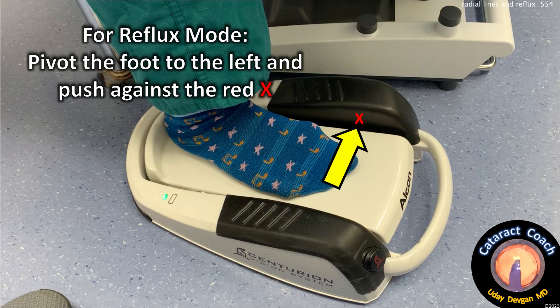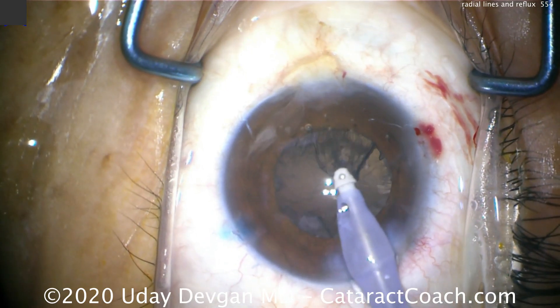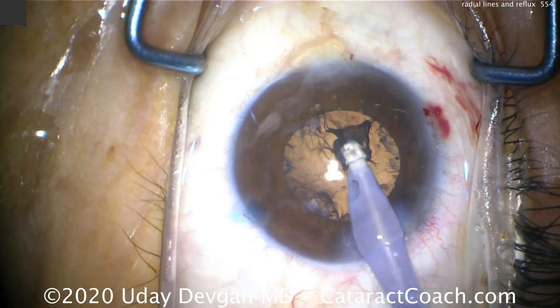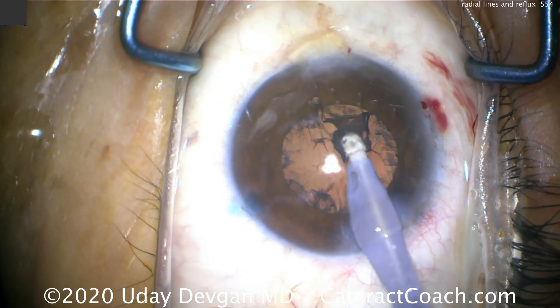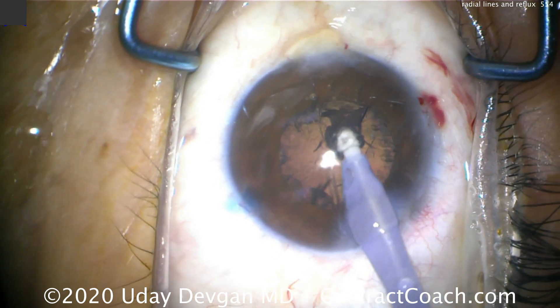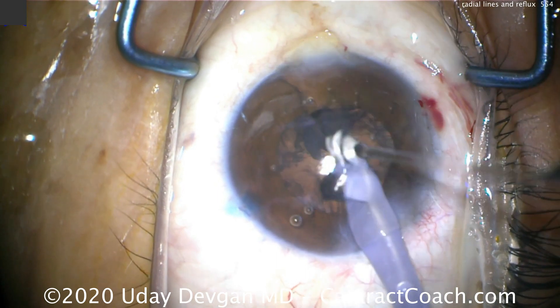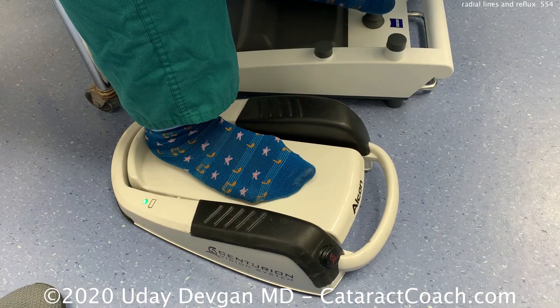Reflux mode: you're pivoting your foot to the left and pushing against that red X — that's how we have it programmed on this machine. Here's a resident doing a case: aspirate in the cortex and then stop — it doesn't release on its own. But if you hit reflux mode, pivot the foot to the left and push on the reflux — watch what happens — it spits it right back out. So it reverses the peristaltic pump.